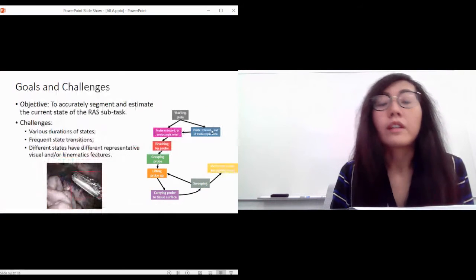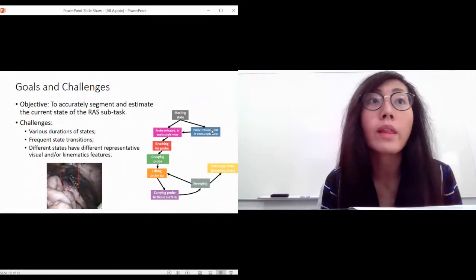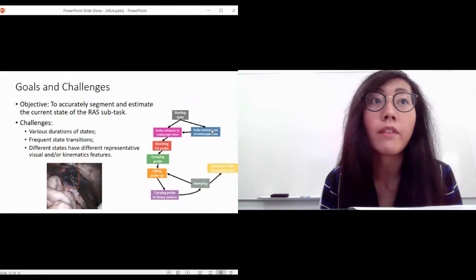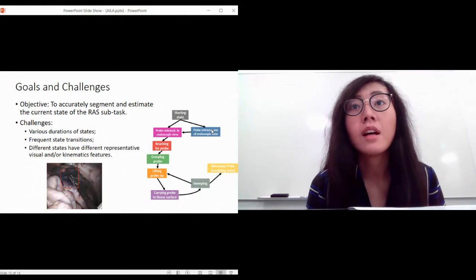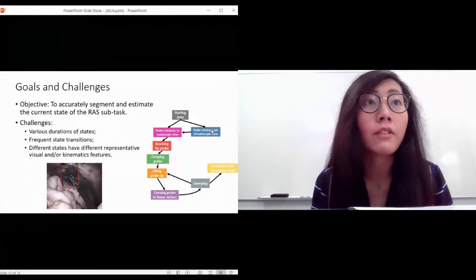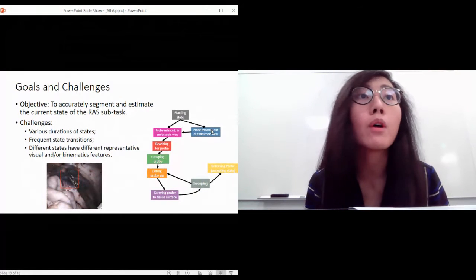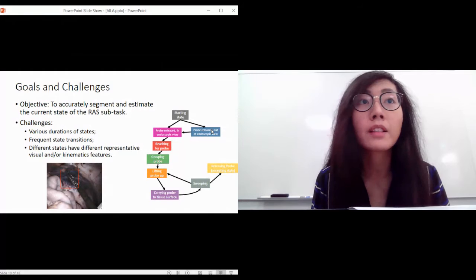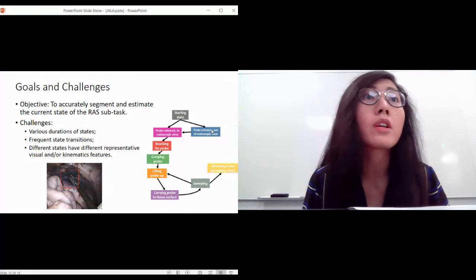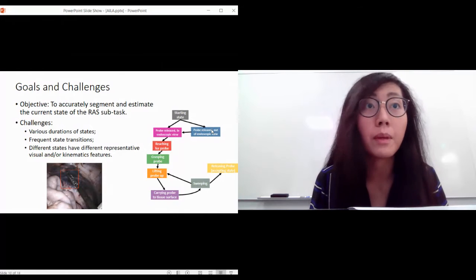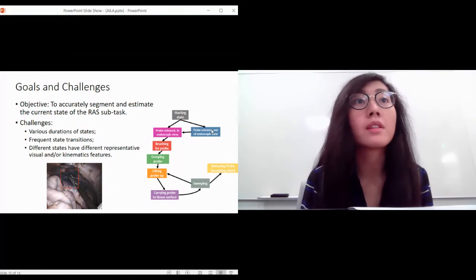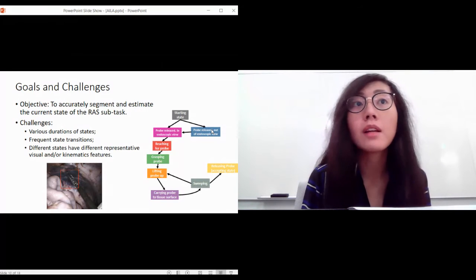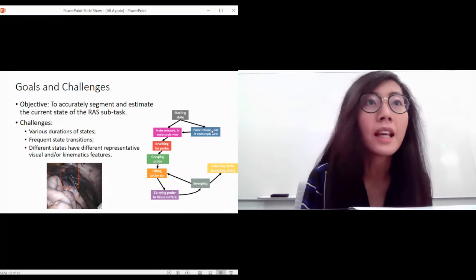Our objective is to accurately segment and estimate this current state, whether it is a gesture or environmental change. There are many challenges - the duration of states varies significantly from one to another. The probe can take a split second, but when the probe is released, that can last 10 seconds or even half a minute. Additionally, we have frequent state transitions because in this very dynamic surgical environment, everything changes very frequently and spontaneously.